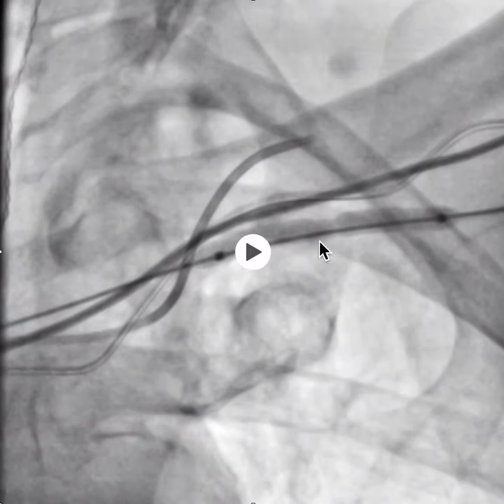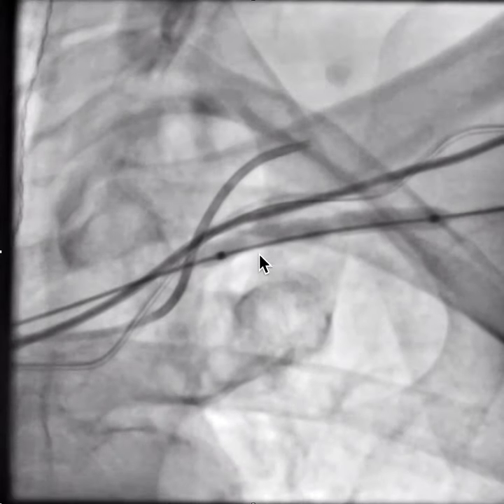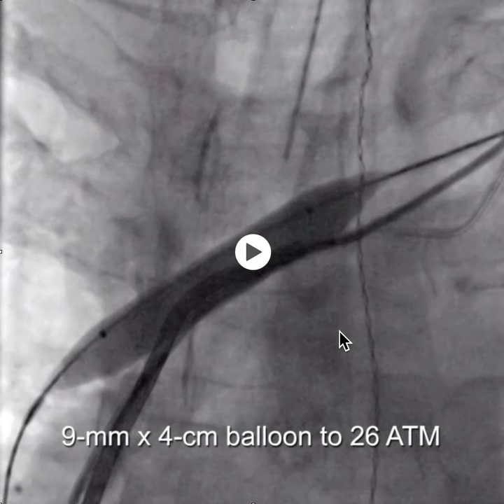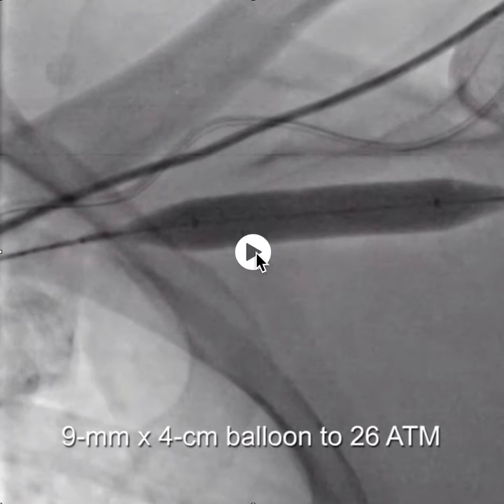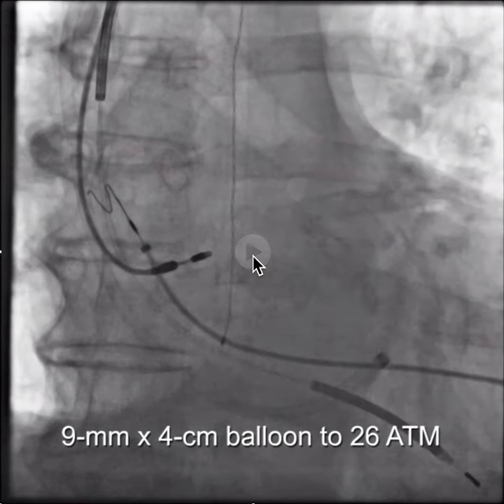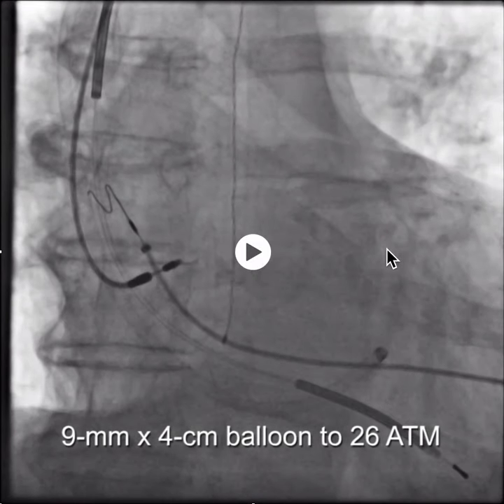We started with a 4-millimeter balloon and then upsized to a 9-millimeter balloon once we had predilated. In the end, this would have been better if, instead of upsizing from an .018 to an .035, we had selected a balloon that went over the .018 wire to start with.